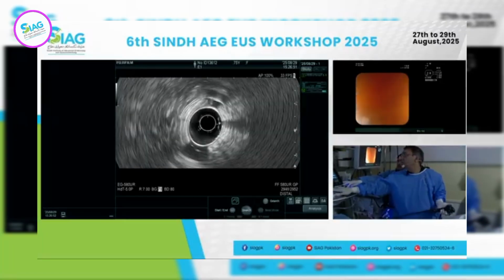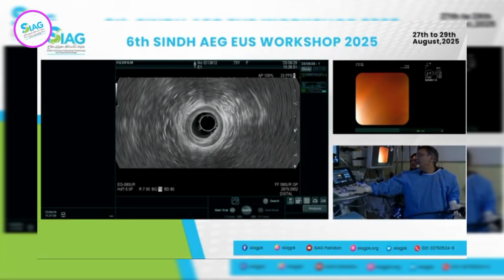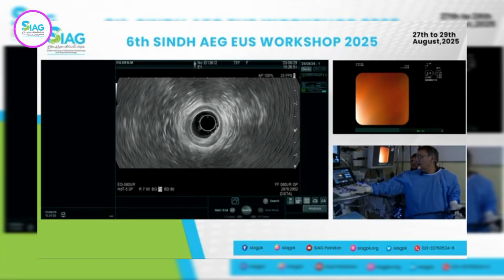Doesn't this freeze? Okay, one minute. So right here, you see how it's becoming a little bit more fuzzy, and then it mixes with the external sphincter right here. Remove the arrow once.